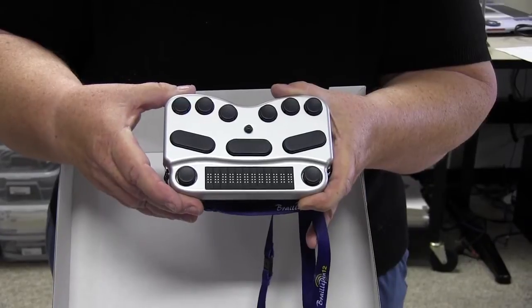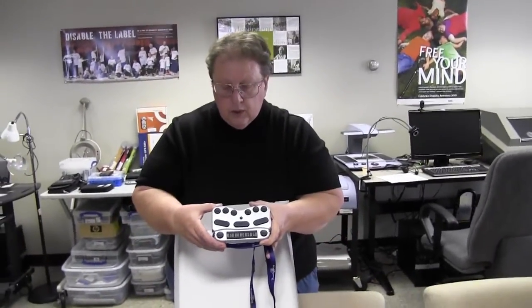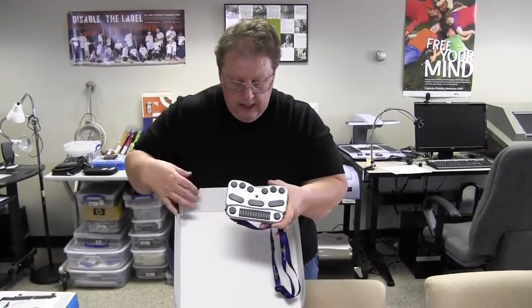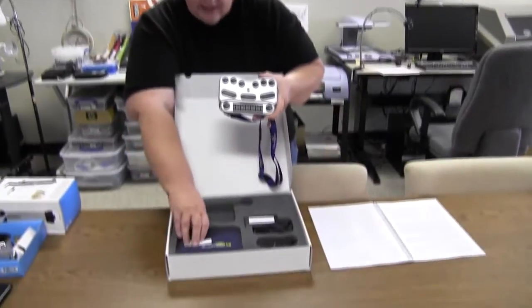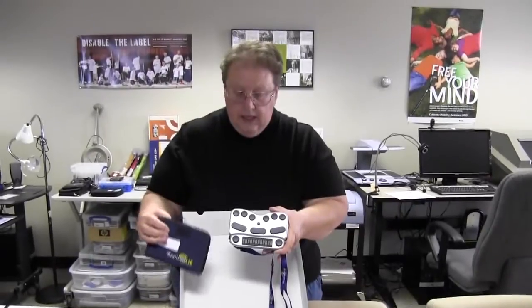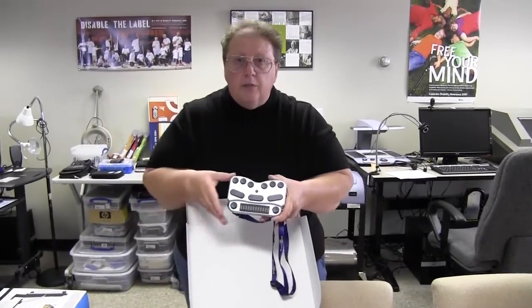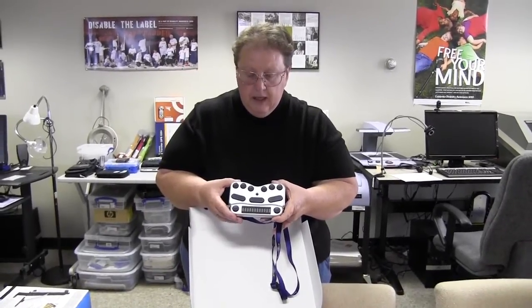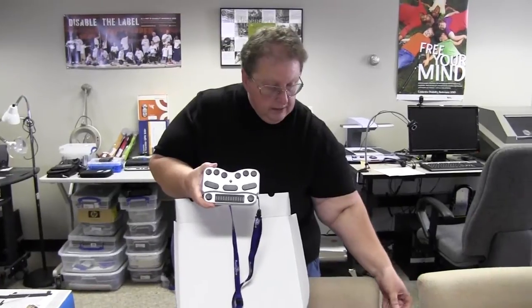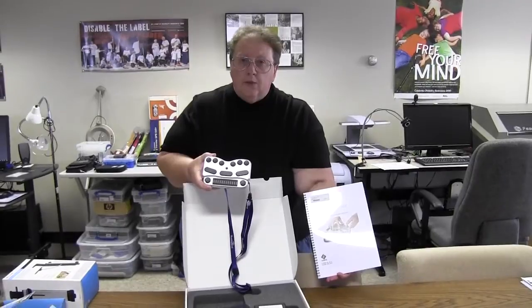And it will work with Android devices as well, which is really cool because now you have some way to type things into those devices. It has a charger and it has a little carrying case here that you can carry it along with you. It's really one of the newer types of Braille devices out on the market at the moment. It does have a manual here, which will give you all the instructions that you need for the Braille Pen 12.